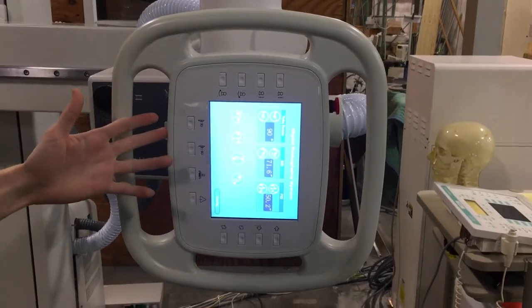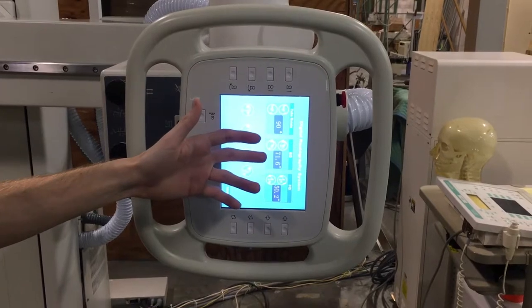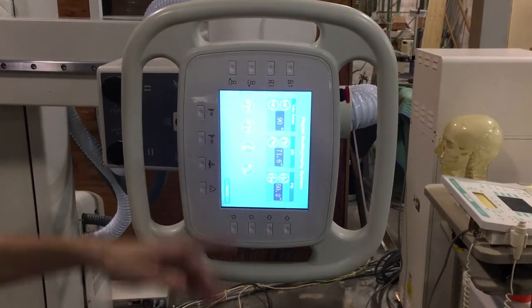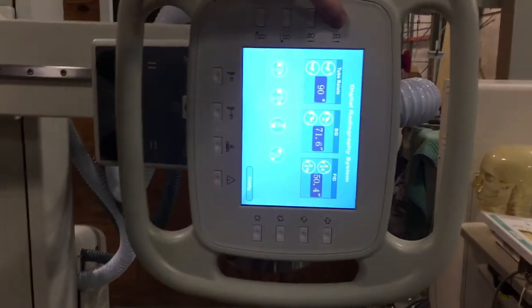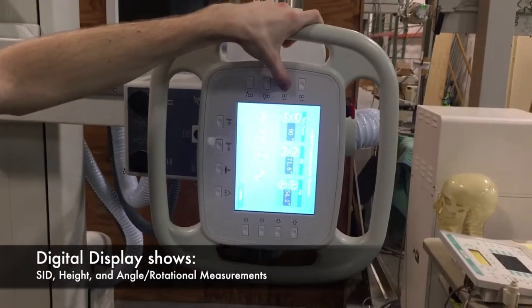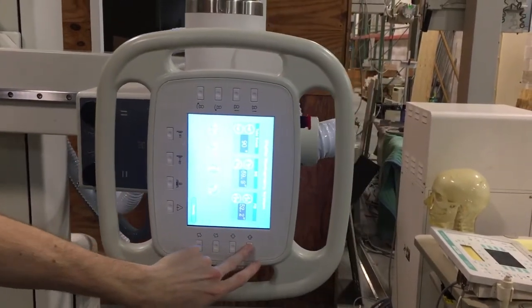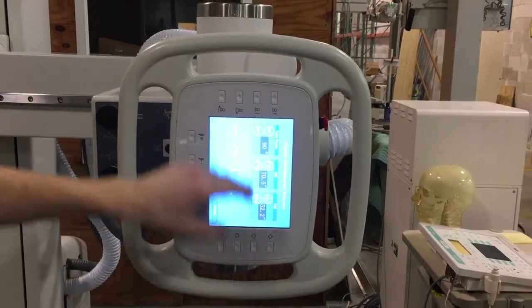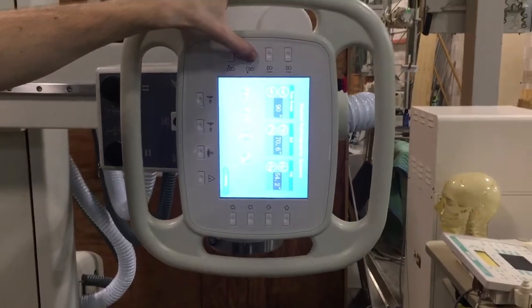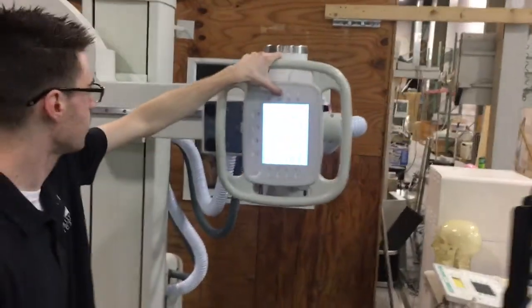Here is the control panel. On here you can see at what angle the x-ray tube is, how far away it is from the detector, and how far away it is from the floor in inches. By pressing the buttons, it'll tell you what distance it is from the floor and from the bucky. When you press the rotation buttons, it's first going to move itself all the way up to the top and then start turning.